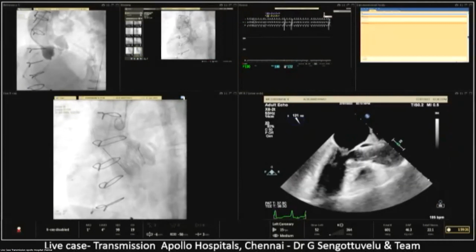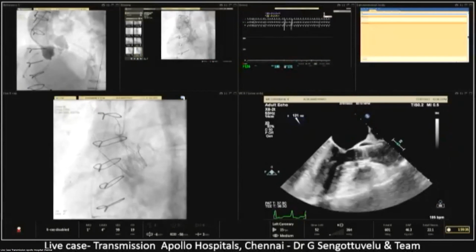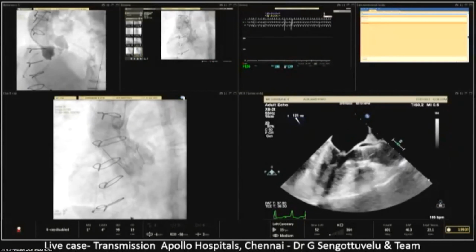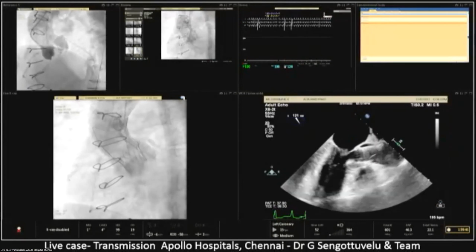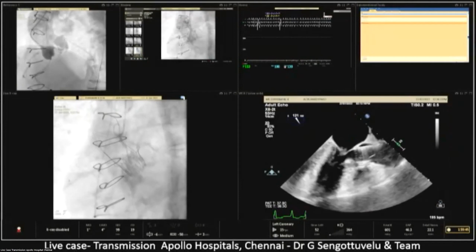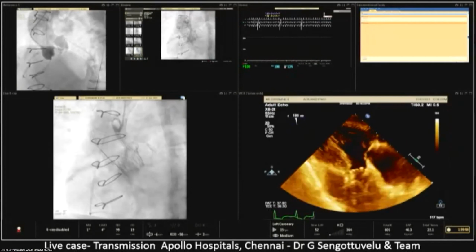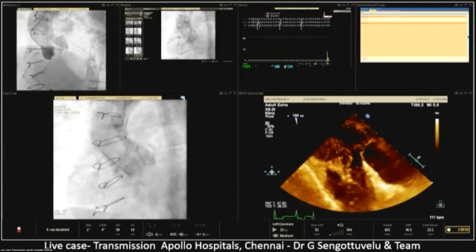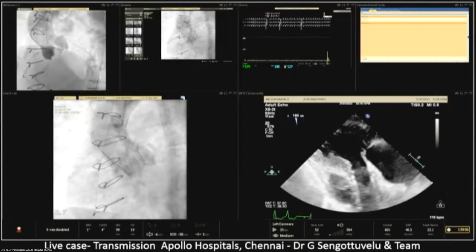We got a good look at this view again. You can see the echo nicely now. Show the final view. On the valve position, at least posteriorly, it looks really good. There's no AR. The hemodynamics are good. The main concern people had was risk of embolization, but now you've observed for about half an hour, and it's been stable. And your point that the stabilization arches and the crown prevent it from going aortic is a very reasonable consideration.